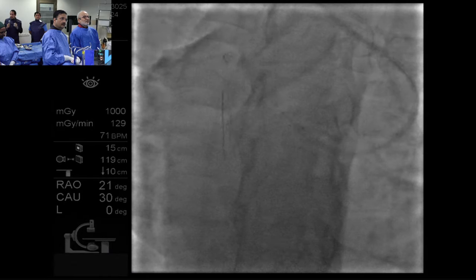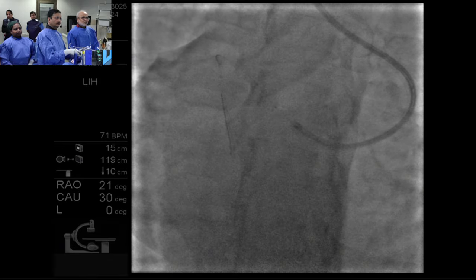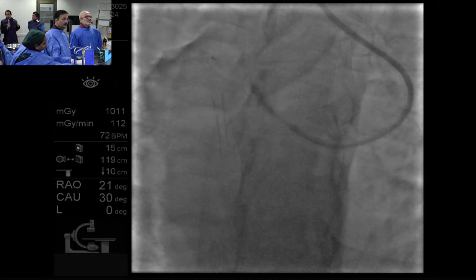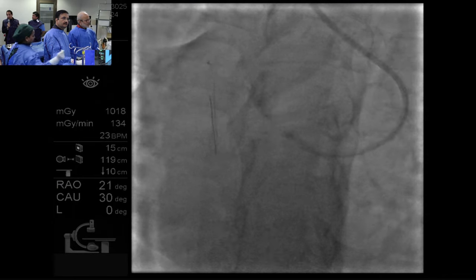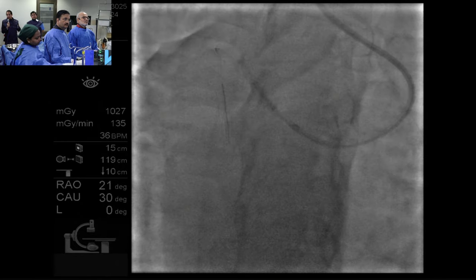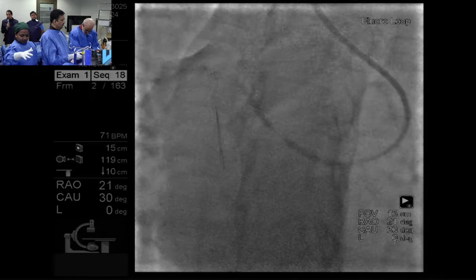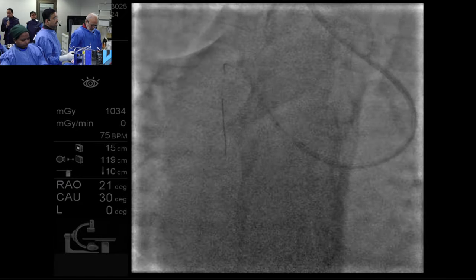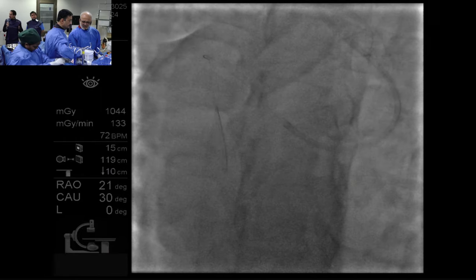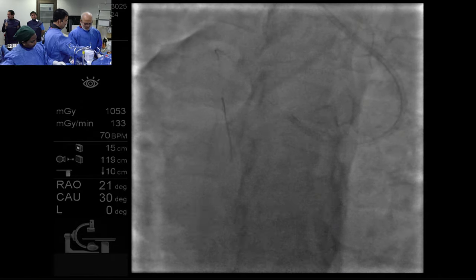Raji, what do you think? Yeah, I agree with you, but I will also say that I've had two perforations with IVL. It's anecdotal, of course, because the data would suggest it should be lower. Both cases were after initial dissection with a non-compliant balloon. So there was already a disruption with an NC balloon, I used IVL to additionally modify, and both had perforations, one required a cover stent. Just anecdote. I don't think we need to high-five saying perforations are finished. It's still going to be an issue.